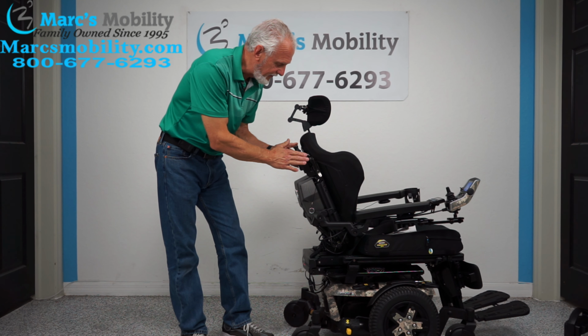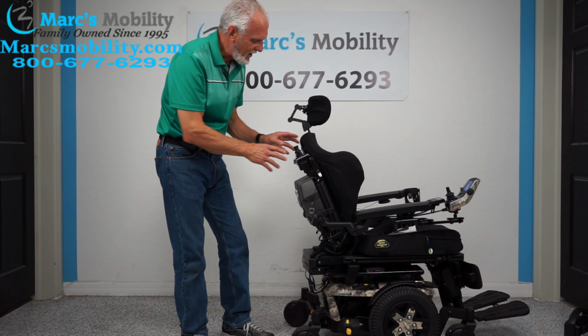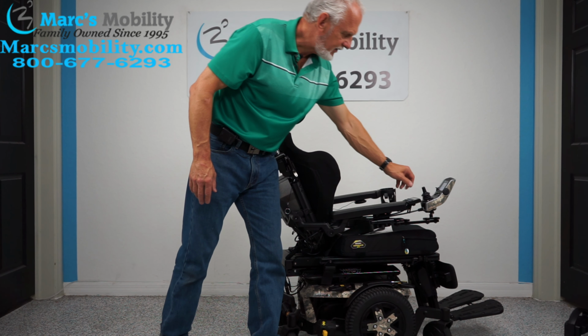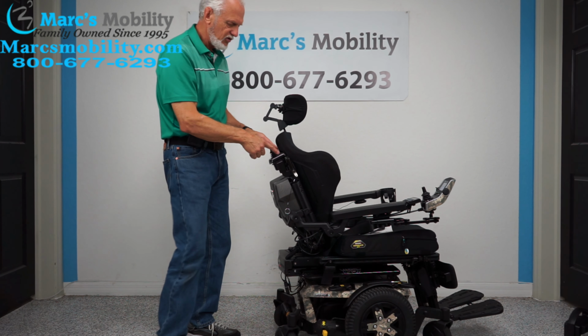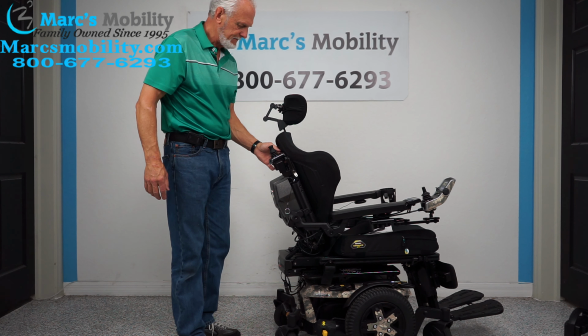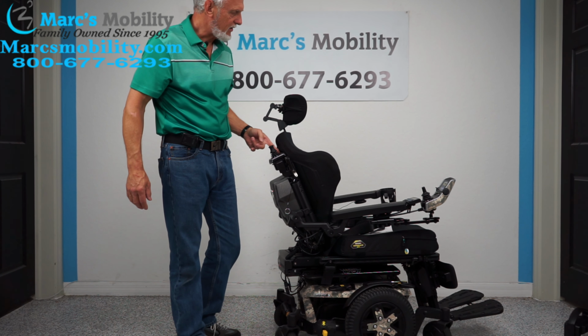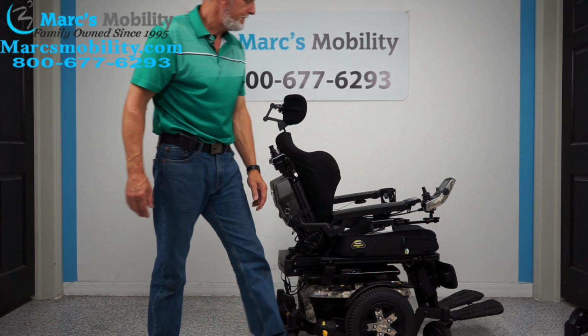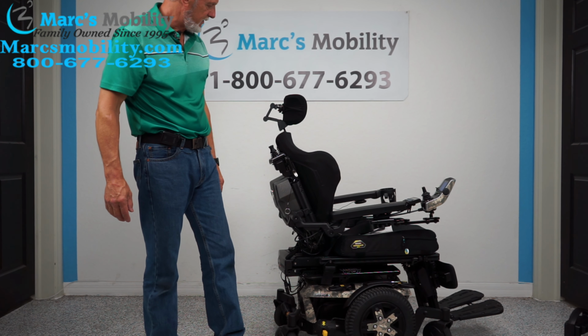It's a nice thing to have, but when you have the Attendant Control, like you see how I'm driving it back, this one is not going to work. So you're not going to have 2 drivers until you switch it back over here. So I'm going to switch it back. Okay. When you switch it back here, you have to turn the power back on up front. So I'm going to turn the power back on and we're back to the front.